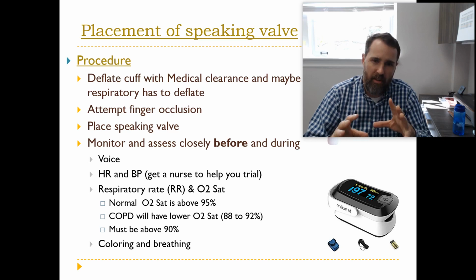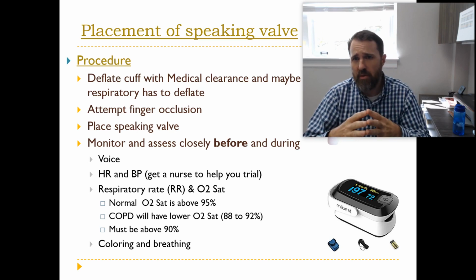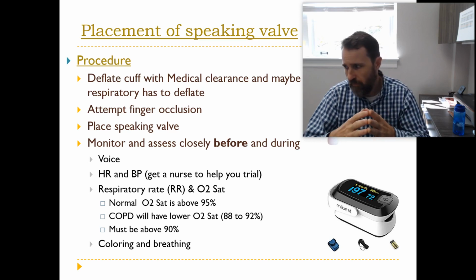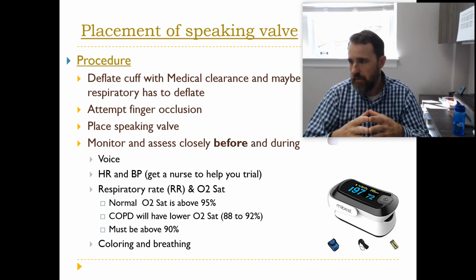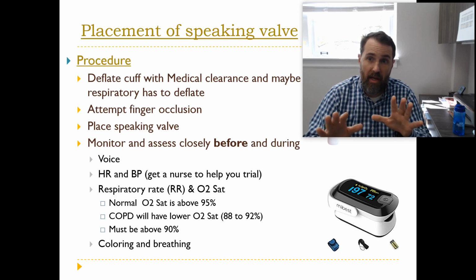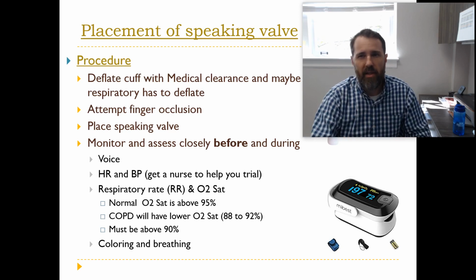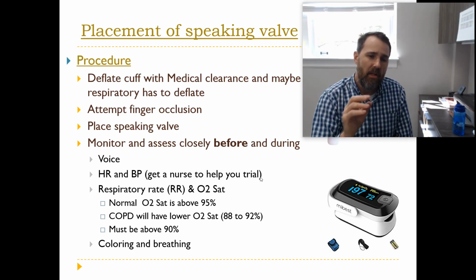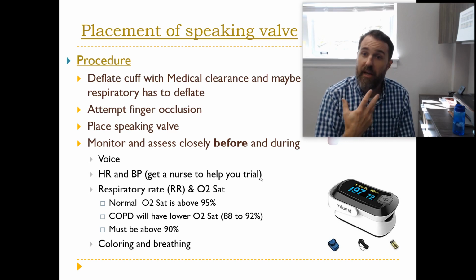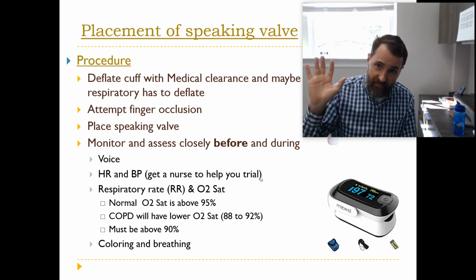COPD patients, chronic obstructive pulmonary disease patients, are going to have a much lower O2 sat, and that's usually in the realm of 88 to 92, and that's low. You always want the O2 sat to be above 90. When Trump was diagnosed with coronavirus, one of the things they came out in the media and they said his O2 sat was at 93 at some point, at some time. And that's just a way of saying it was a little bit lower than it should have been. And obviously, as you're going through the placement of the speaking valve, you want to be observing the coloring of the patient and the breathing of the patient. If you turn around and look at them and they're purple or red and not breathing, that's a problem.